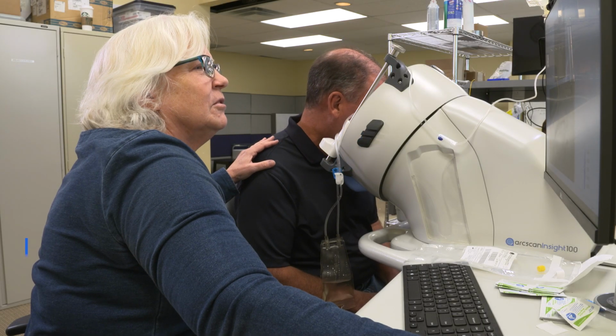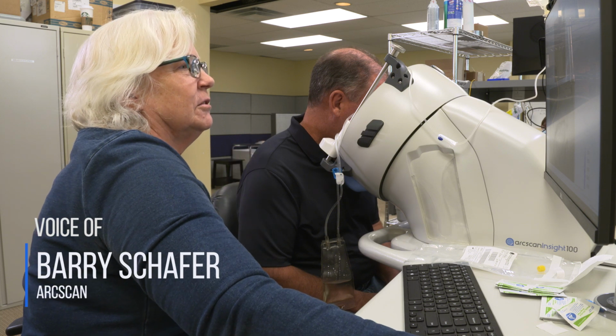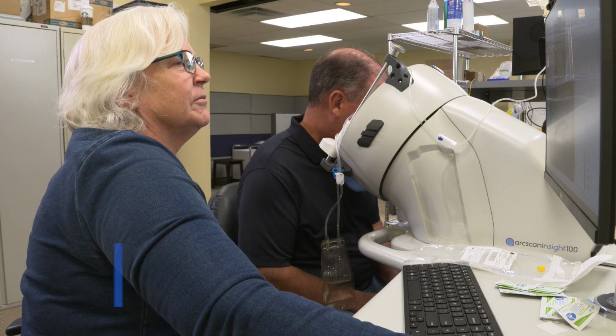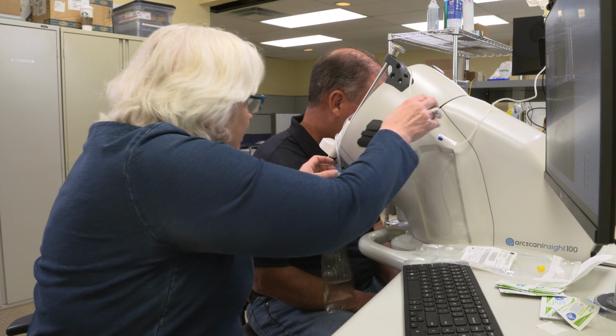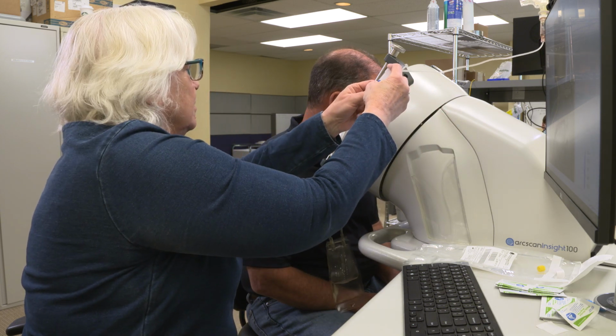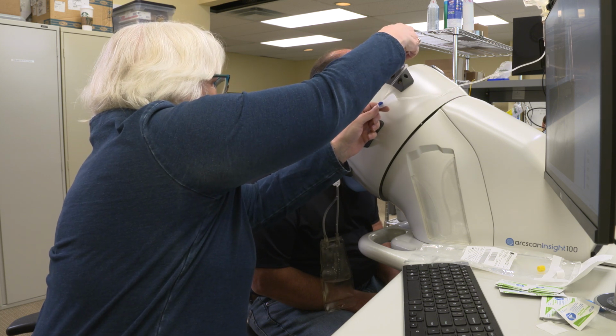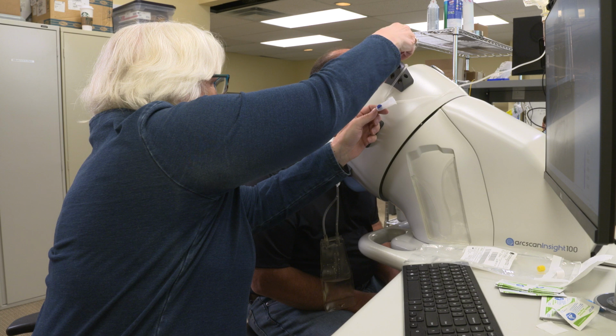This is a quick overview on the Insight 100 of some common mistakes that happen while trying to image a patient. Not all of your patients may be cooperative, or maybe it's been a while since you've used the instrument. So we want to demonstrate to you some of the common error codes and how to resolve them.